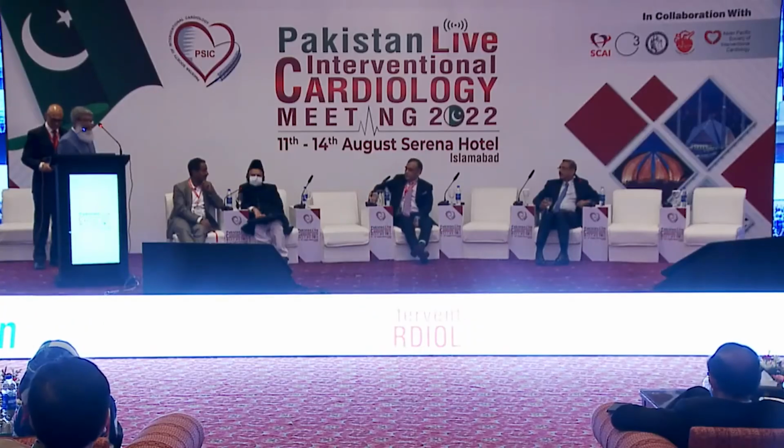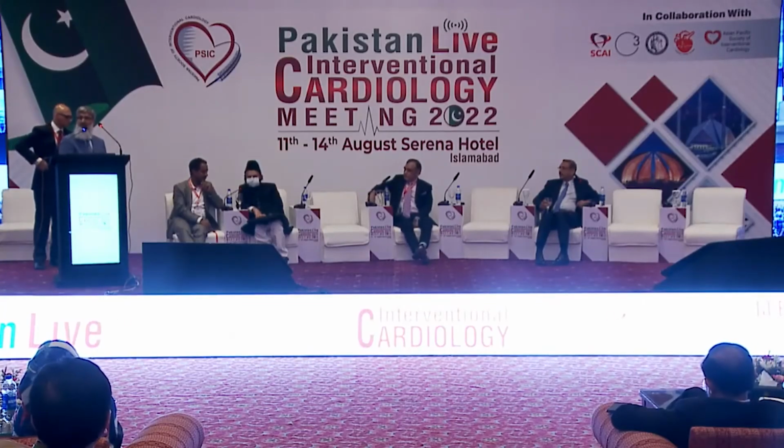Professor Simar. Do a delayed TAP. I think the whole coronary tree is very tortuous, and the proximal circumflex also doesn't look like a straight segment, and this should be dealt with as a left main bifurcation lesion, really.